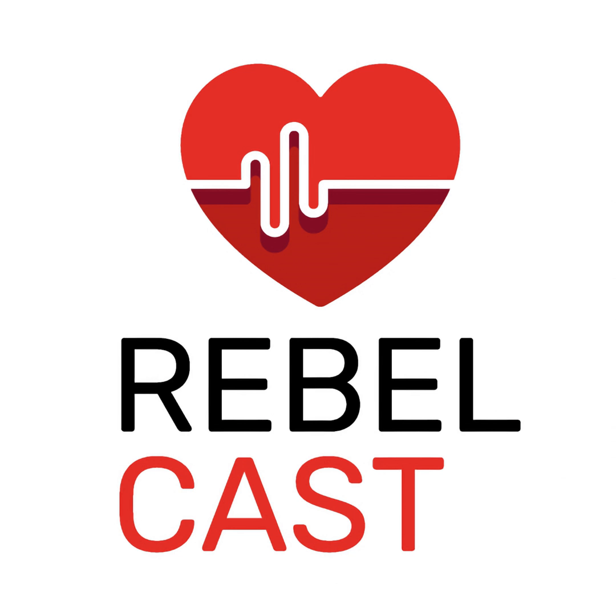Again, in assist control volume mode, or volume control as people refer to it, they can only take two types of breaths: assist or controlled. They're not really getting controlled unless a few things. They're paralyzed, overly sedated, maybe brain dead, or have a severe brain injury, and they're just not triggering it. Then those will all kick in. Every 6 seconds, they'll get a breath with a rate of 10, and they'll get a control breath.